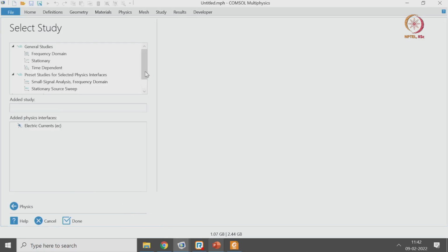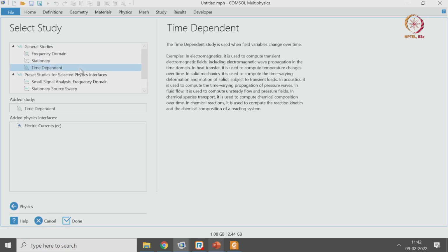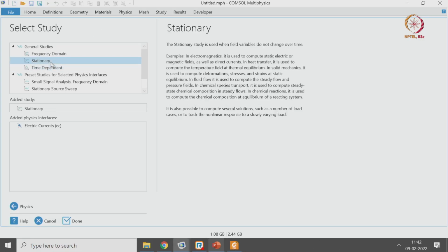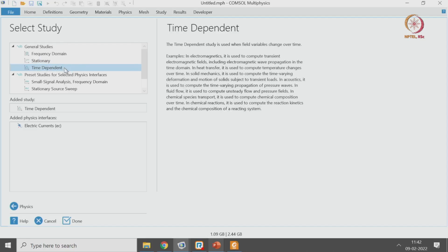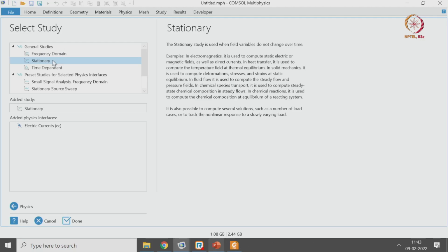Then the tool asks which kind of study I want to perform. You can do a frequency domain study, that is a harmonic input, or a stationary study, meaning a direct current, that is a DC study, or you can also see it as a steady state study, that is, what it would be at time t equal to infinity. Or I can do a time dependent study, where I need to mention the time scales of the model. There are also other options such as small signal analysis, where you can have both a DC bias along with a frequency domain signal, and you can do a sweep, and there is eigenfrequency analysis, but we are not interested in those as of now. We are interested in only the steady state analysis, that is a DC analysis, in the case of a static analysis. So I just select Stationary and click on Done.